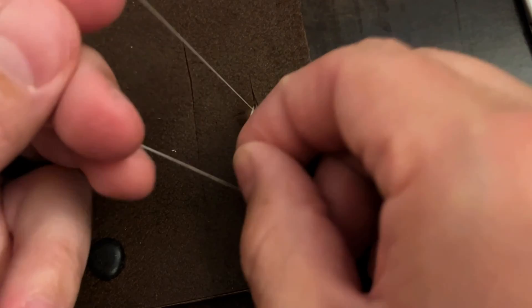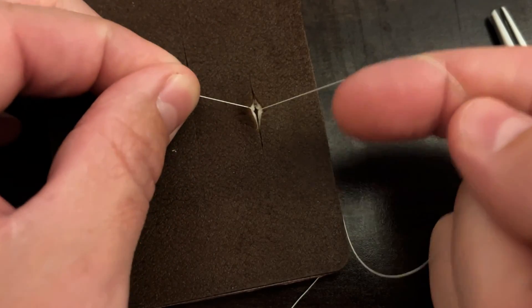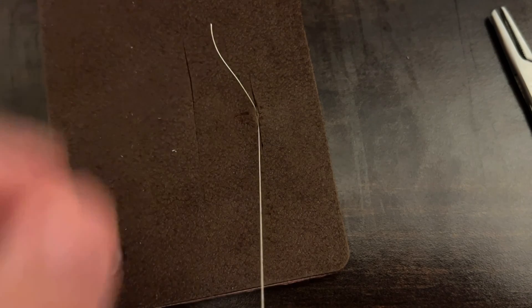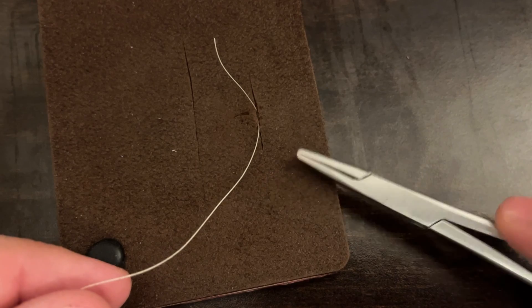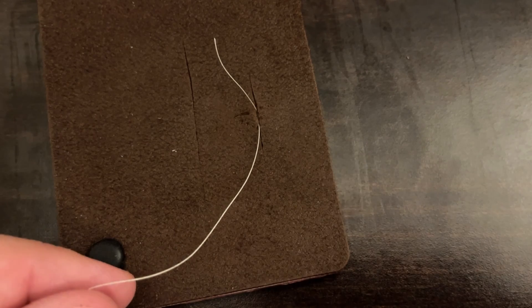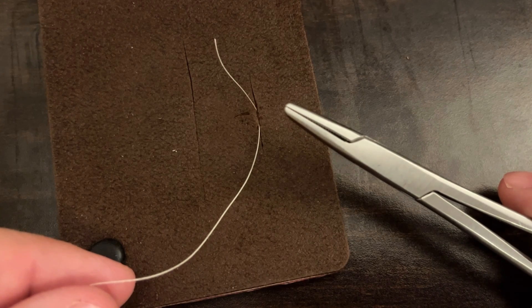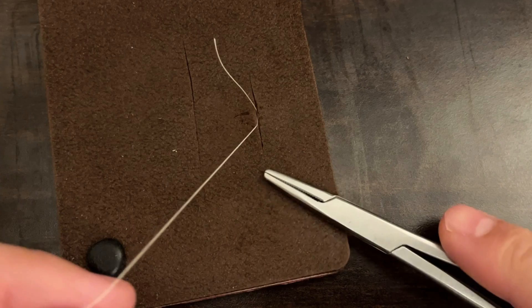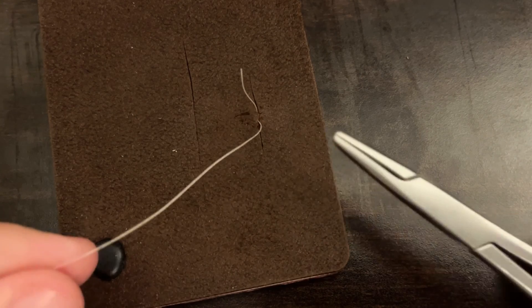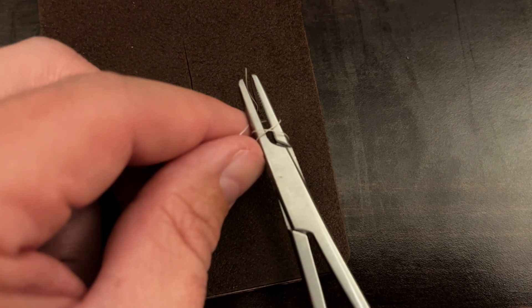We're going to tie this using an instrument tie, just like we do with a lot of our skin-level closures. Make sure that my loops are just like that and my tails are free and not twisted around each other before getting started. If you are not feeling fully comfortable and skilled in your instrument tie, please practice that — you can check out some of my instrument tie videos. Now I'm going to start here in the middle and quickly instrument tie this.